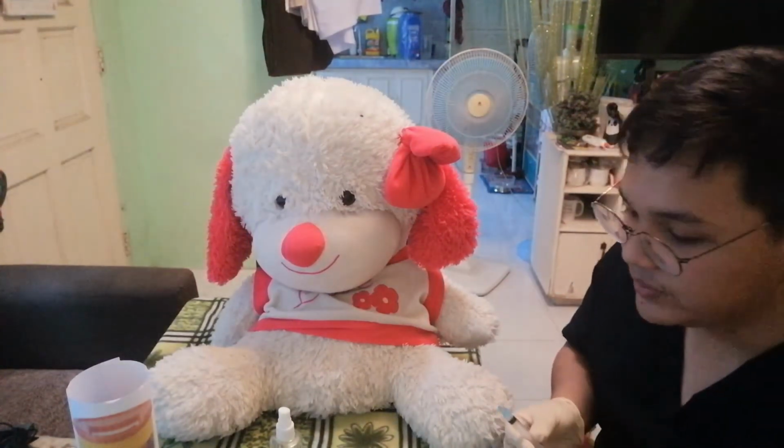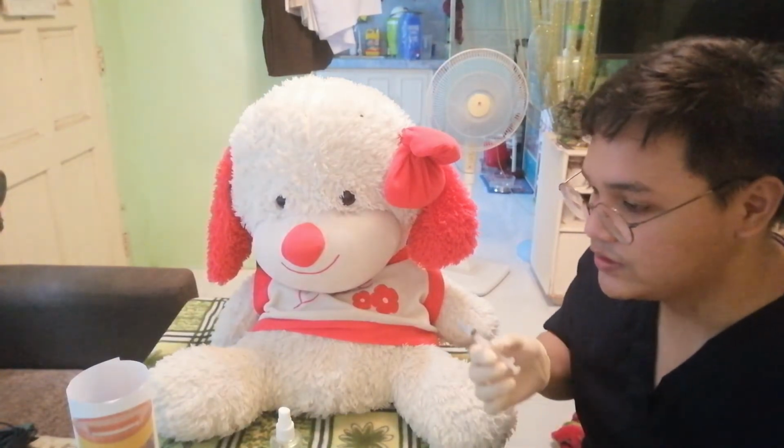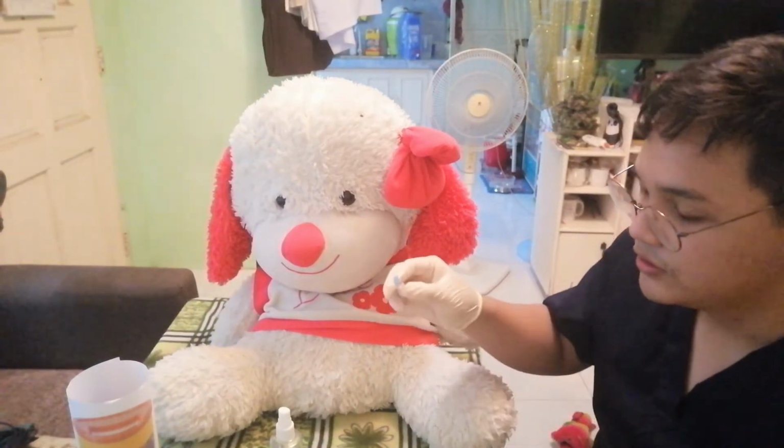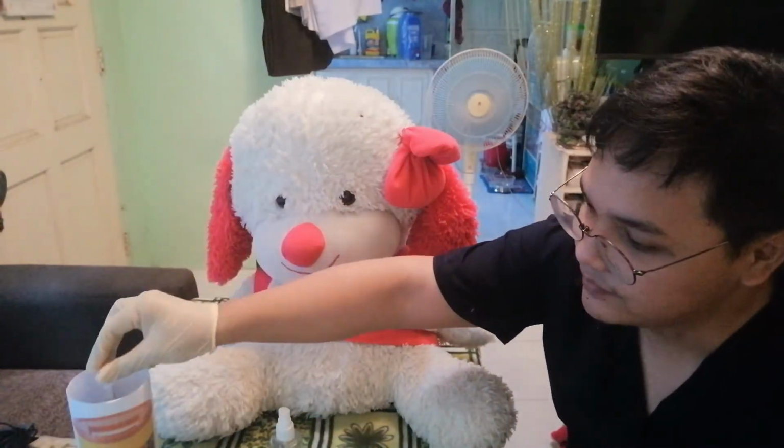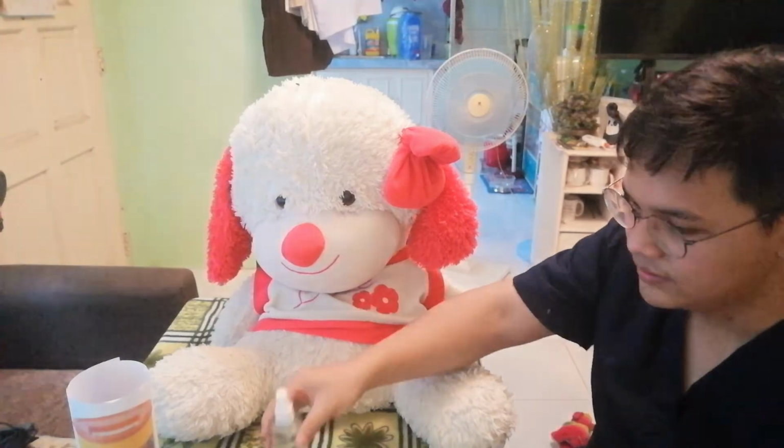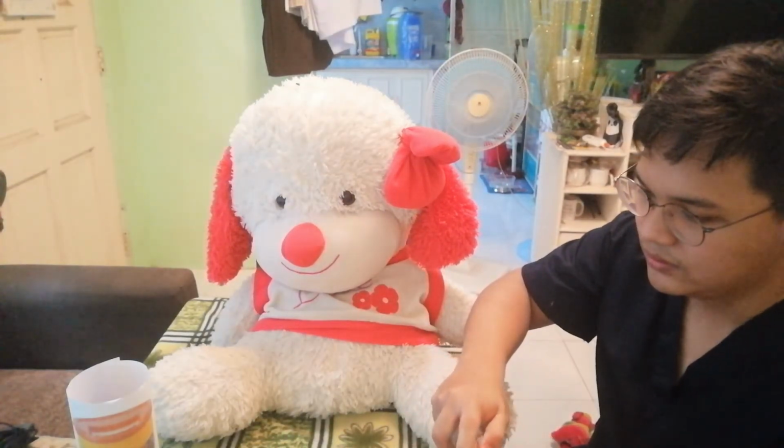Now we will need to dispose of or discard our needle in the appropriate receptacle, or our sharps container. And after that, we will now proceed to our next step, which is to remove our gloves. After removing our gloves, we will need to perform hand hygiene.